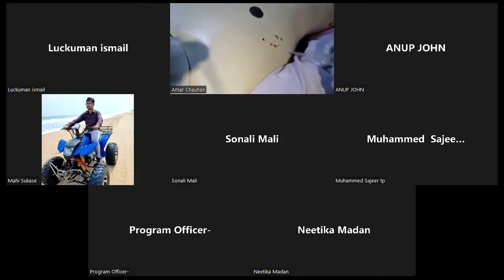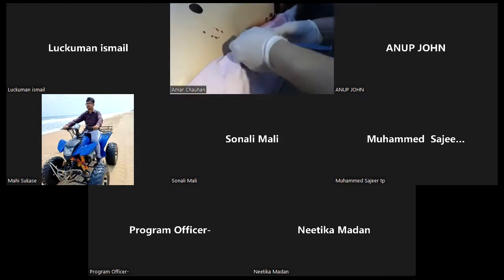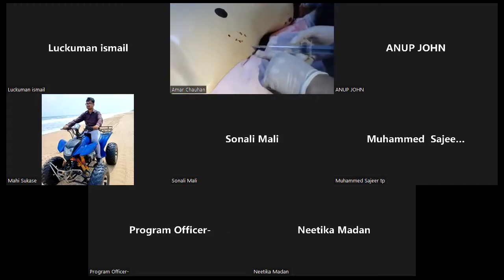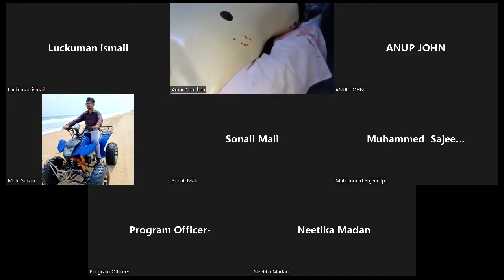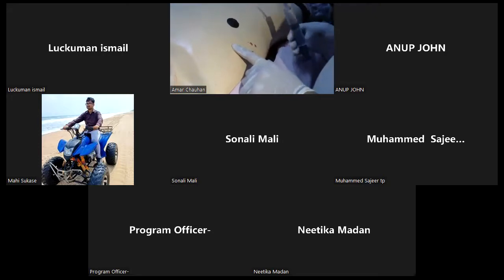Lukman, are you seeing the intervention I'm doing? Yes. Could you see the decompression of the tension pneumothorax? Would you like me to demonstrate again? No, we are able to see.